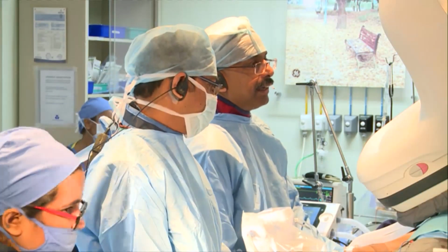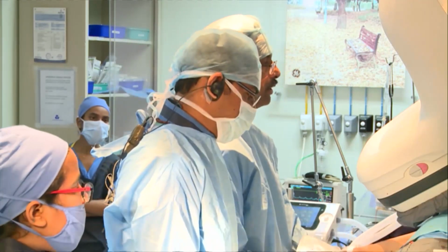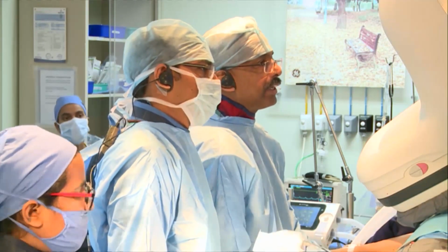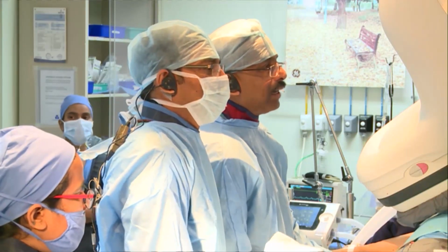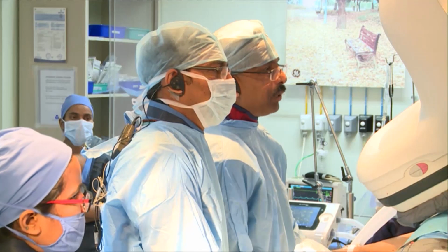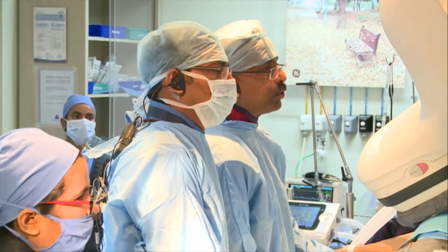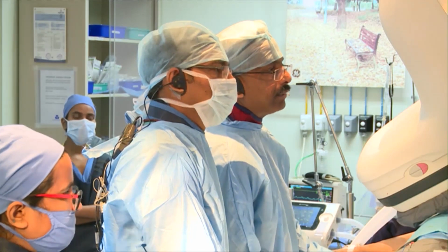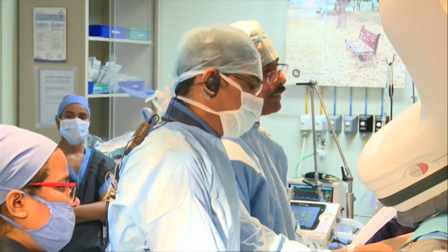And I think that ECMO has limited use in these patients because it will not unload the ventricle, and most patients have high left ventricular end-diastolic pressures. So I think the choice is really number one, impeller, and number two will be IABP if you don't have the impeller. That's it. I have no doubt about that.